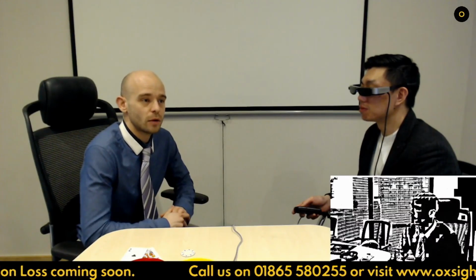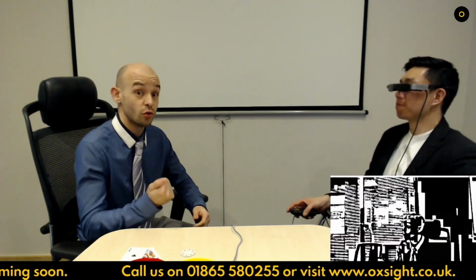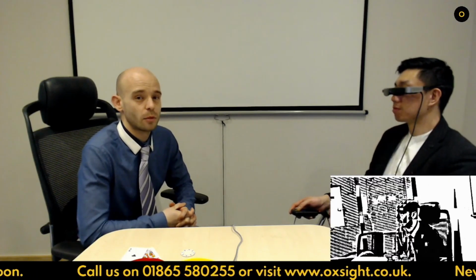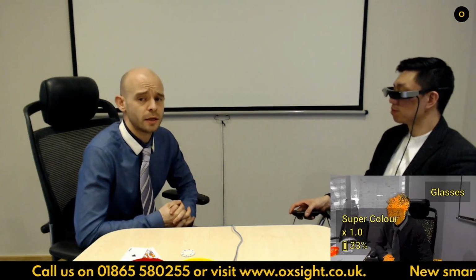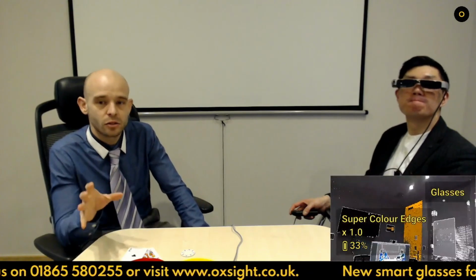And I know that I've been told many times, some people like white on black, some people like black on white, and it's about putting that environment in your hands so you can choose what you want to use it for. And what we'll go on to next is super colour. If we take it to super colour edges, this one. Perfect.